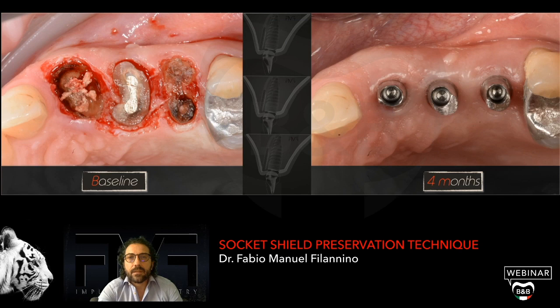But finally, I want to show you what we achieved with this technique, with this very conservative, flapless, no biomaterials, very minimally invasive technique, using even very few drills, only until 2 millimeters.